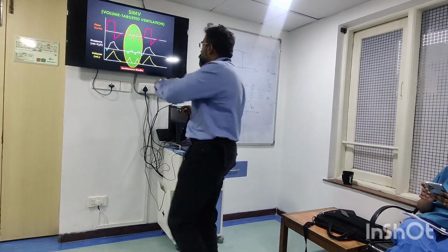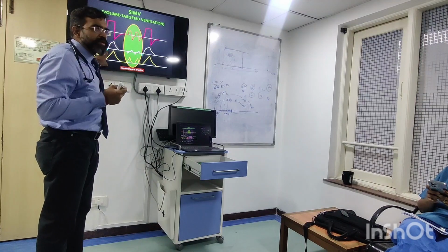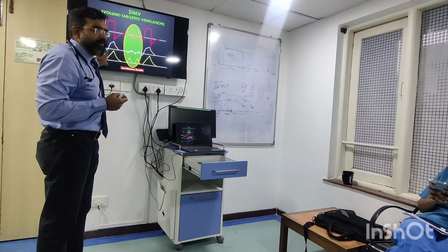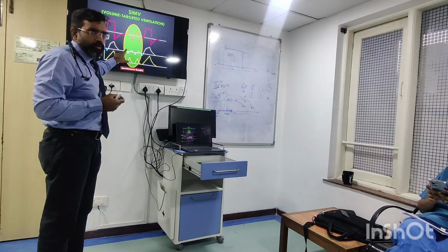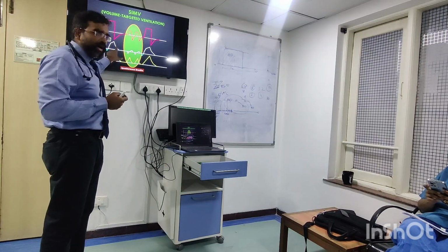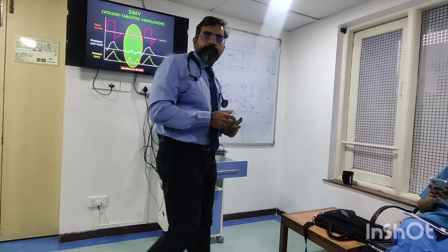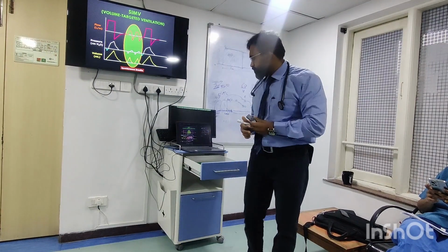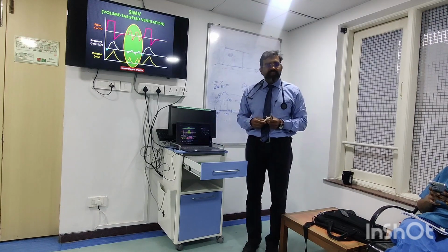So I would set say 2 centimeters of water. If I come to 2 centimeters, then this breath will be supported by volume control. However, whether I have to do that in the first place will depend on the period. So in that SIMV period, if the patient takes 2-3 breaths, will it deliver that? No, it will not.